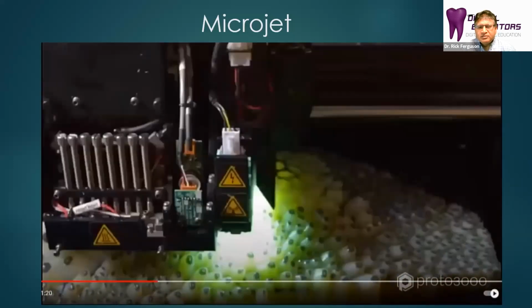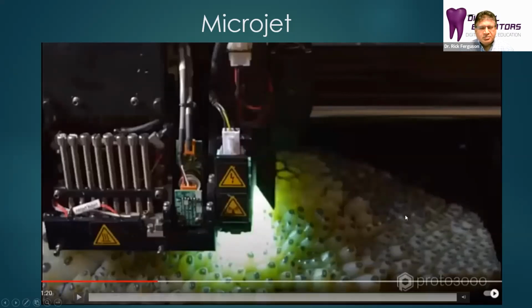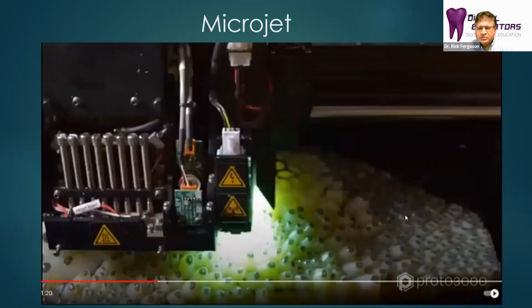The microjet is nice because you can produce different colors in the final printed object, but it is very complex. There's a lot of moving parts, and because of that, it's also a very expensive process. So we're again typically not using microjet printers in a clinical practice, but some laboratories do use microjet printers as well.